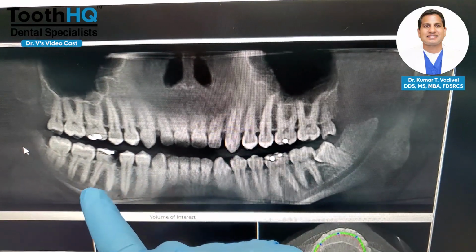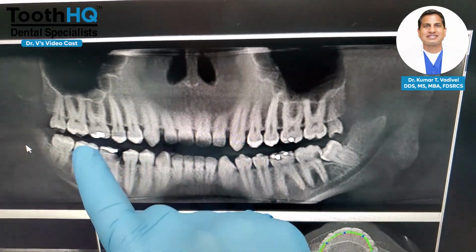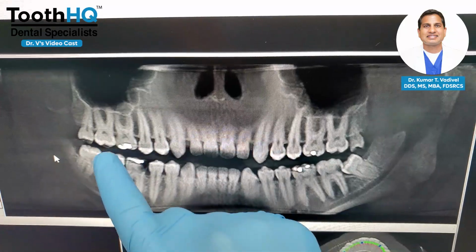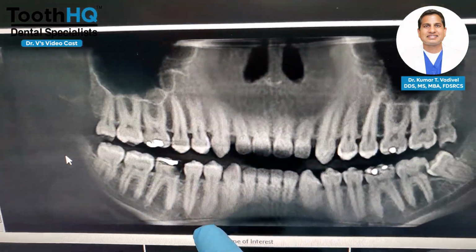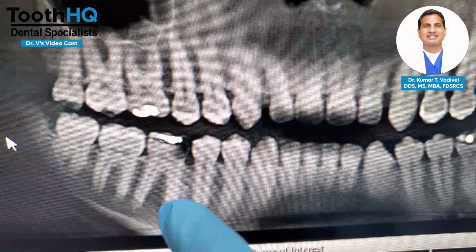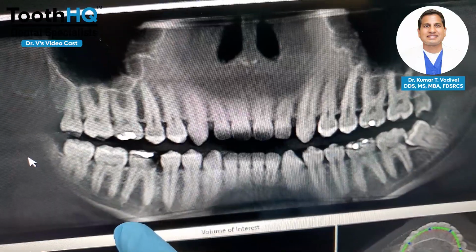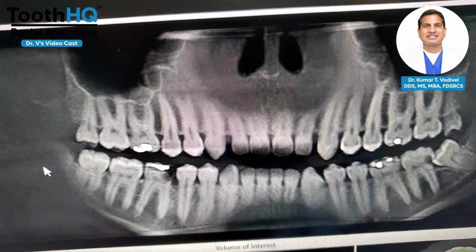We are doing a socket preservation here on tooth number 30. You can see here, tooth number 30, that's the tooth. So we already removed the tooth, and we already went over the basic extraction technique. So we are just going to go over how we are going to do the socket preservation.